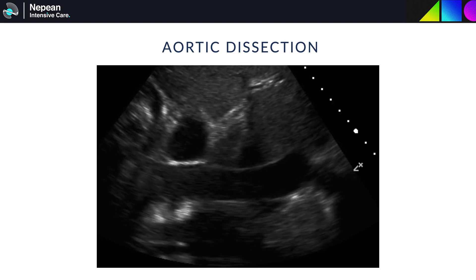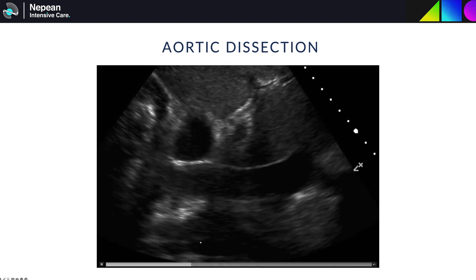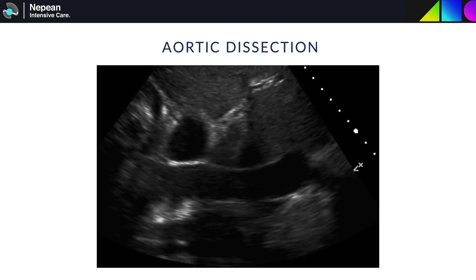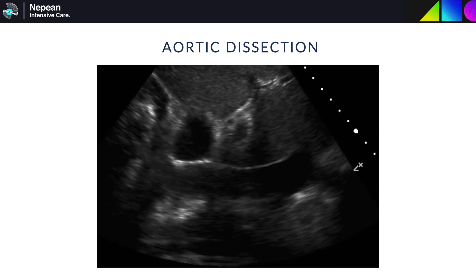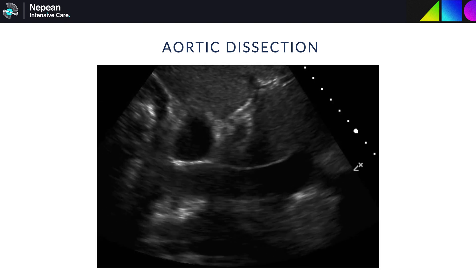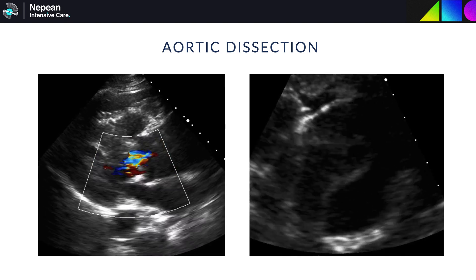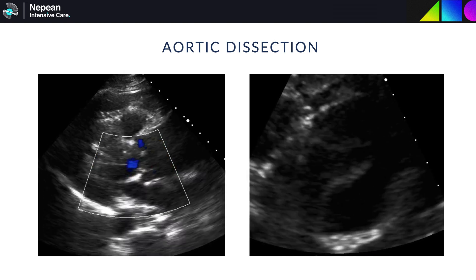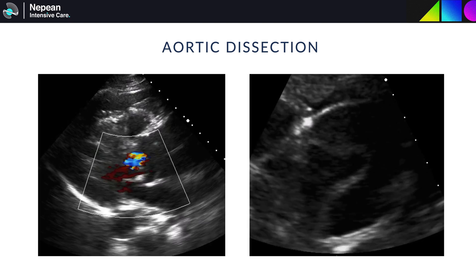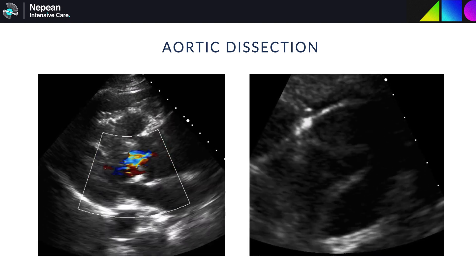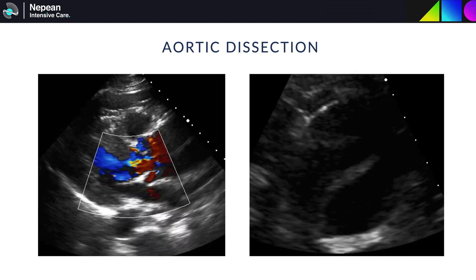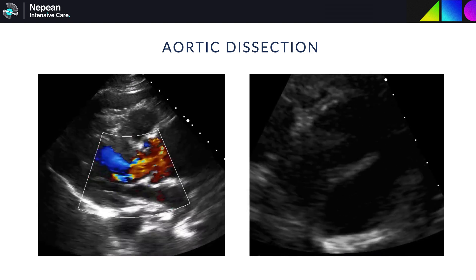Occasionally, ultrasound may reveal an intimal flap that can be seen in the aorta. Ultrasound has quite poor sensitivity for this — CT is the imaging method of choice — but just be aware that you may get incidental findings. Remember that if you see a dissection, perform an urgent echo to see if there are any complications associated with a type A dissection. As seen here, there is a type A dissection with a dissection flap in the ascending aorta with associated aortic regurgitation and pericardial effusion.